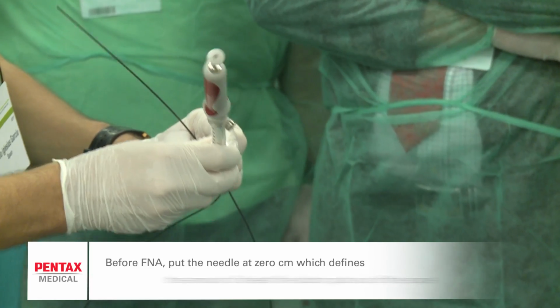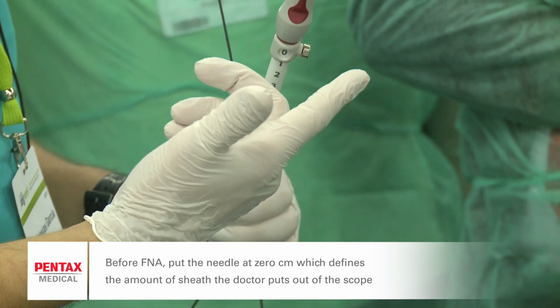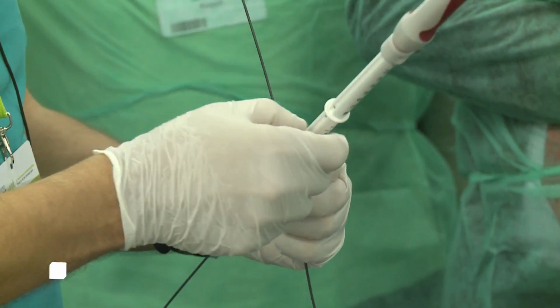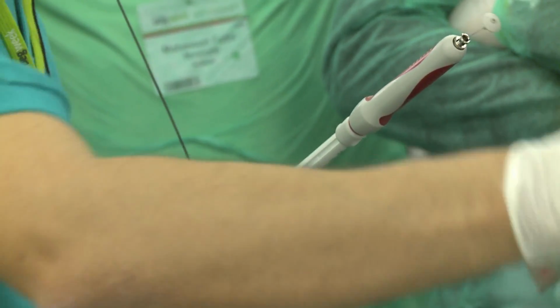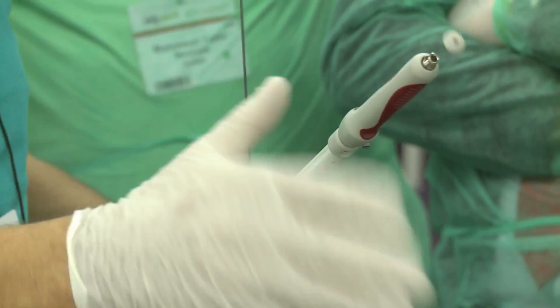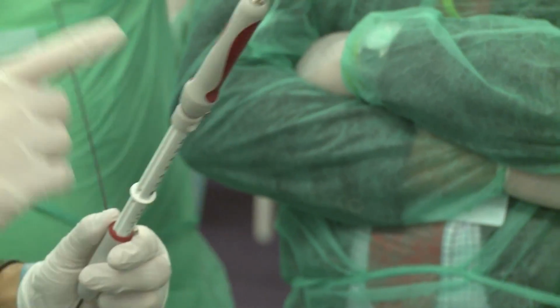What is the meaning of putting it at 0? That I will decide the amount of sheath I want out of the scope. It comes preloaded, standardized at 2 centimeters because it is the size of the case. Both companies, Boston and Cook, put it at 2 centimeters, but that's just because of the arrangement to put the needle inside of the case. So we put it at 0.